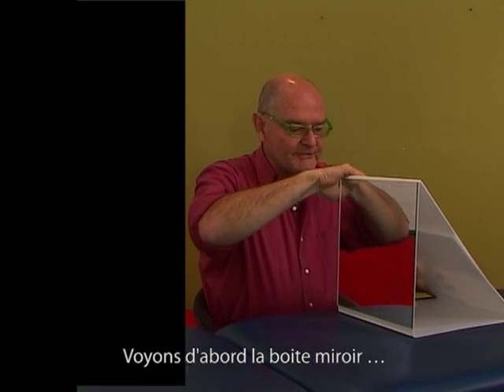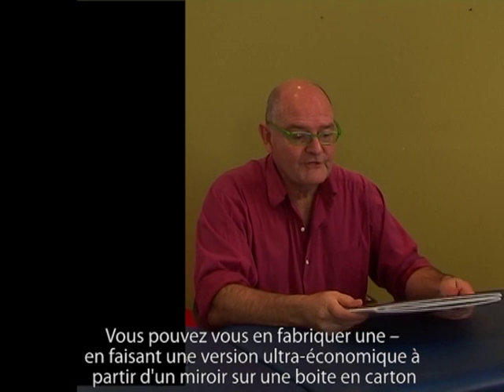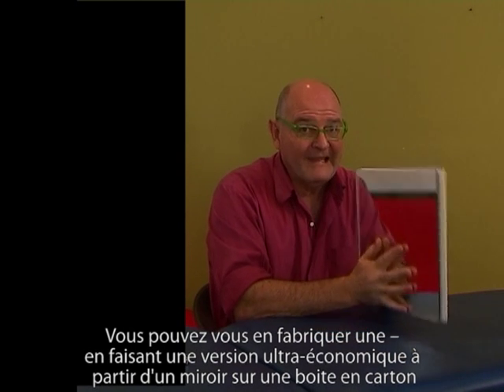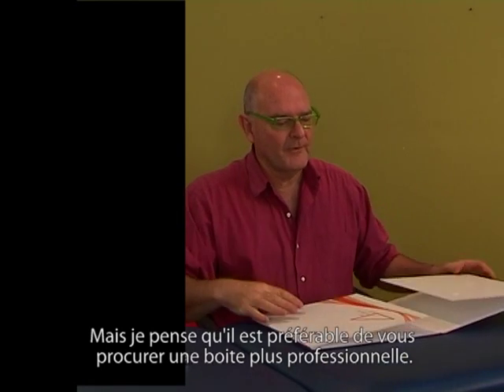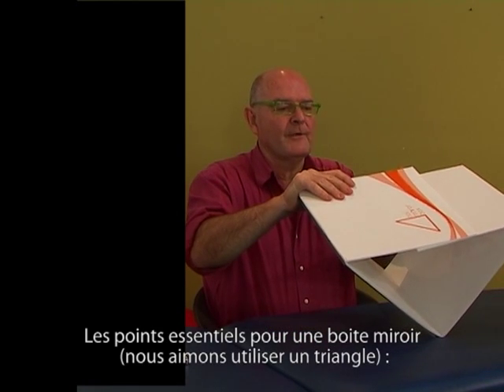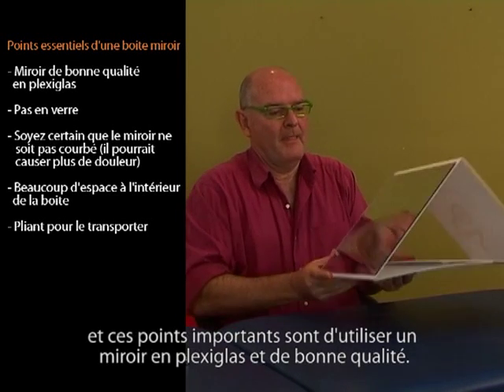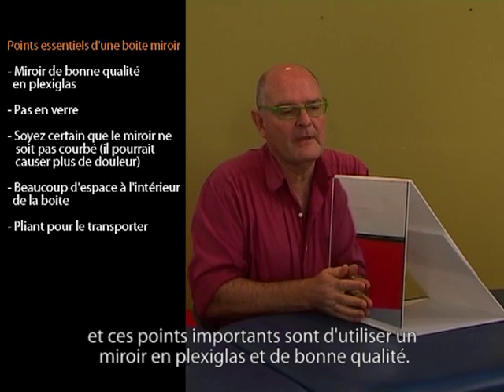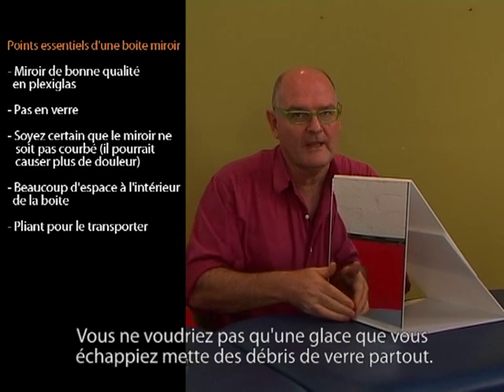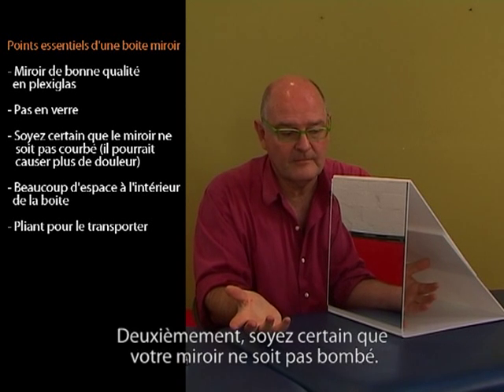The mirror box first. You can make your own. You can do the ultra cheap version of a mirror on a beer carton, but I think it's best to get yourself a more professional box. Key points from a mirror box. We like to use a triangle, and the key points are that the mirror is perspex and good quality. You don't want a glass one that you're going to drop and have glass everywhere.